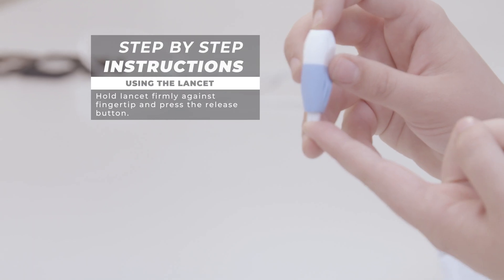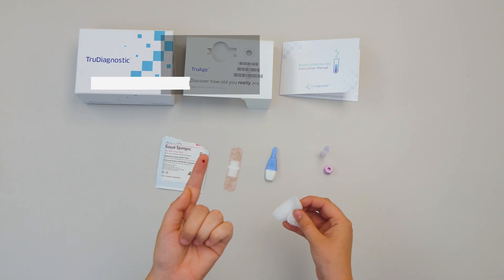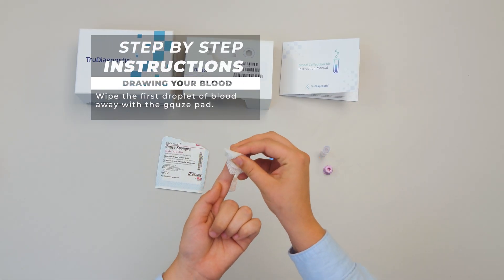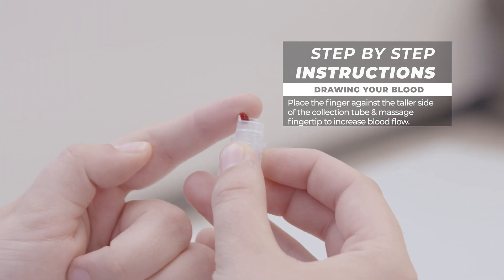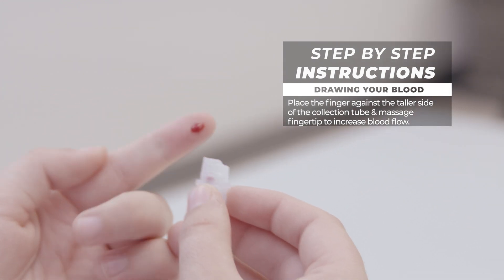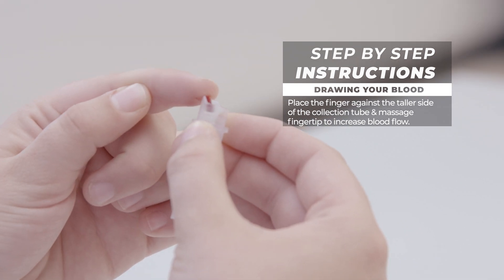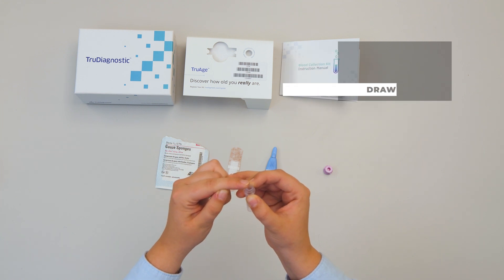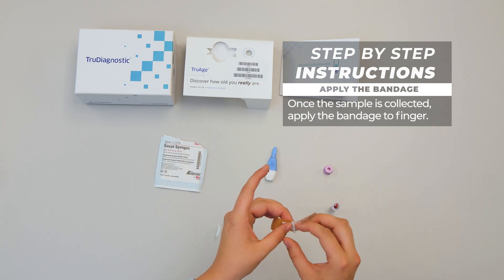Use the lancet and press the release button. Wipe the first droplet of blood away with the gauze pad. Place your finger against the taller side of the collection tube and massage your fingertip to increase blood flow. Once the sample is collected, apply the bandage.